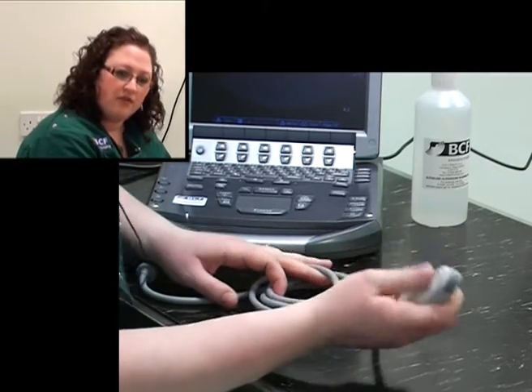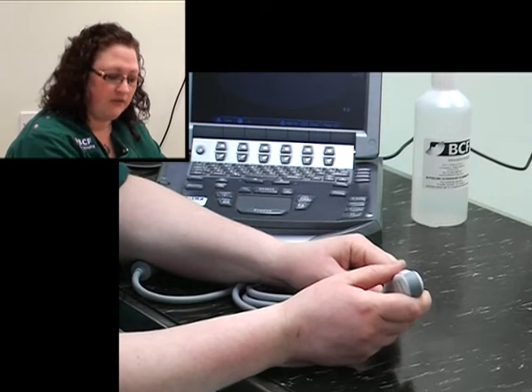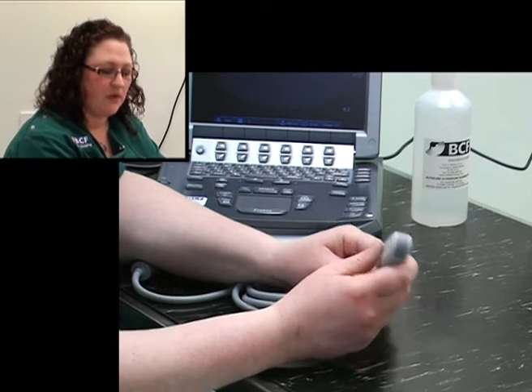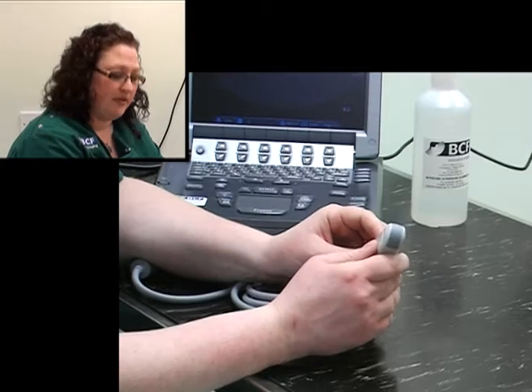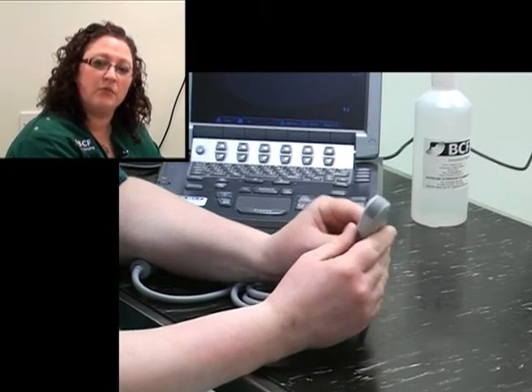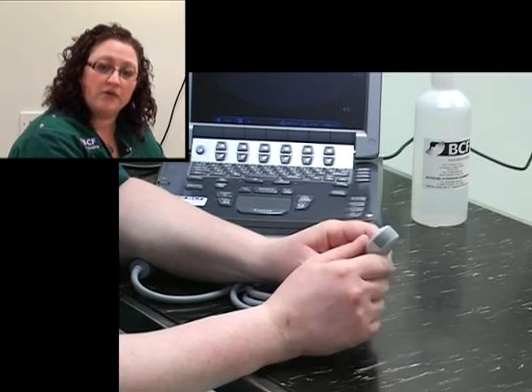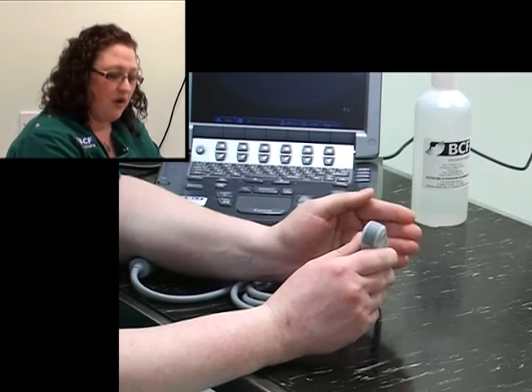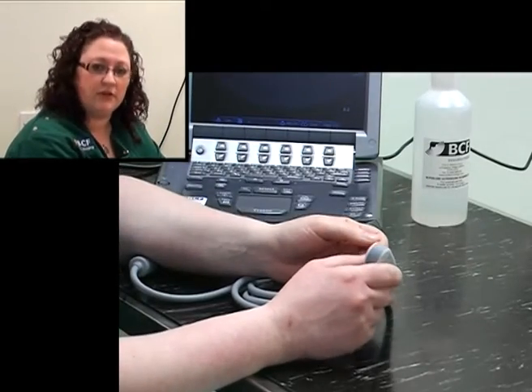Another good thing about this type of probe is that it will be very useful for a wide range of patients, all the way from cats to larger dogs. This particular probe has multi-frequency capability, which means you can actually change the frequency being emitted from the probe itself. Higher frequencies are used for better resolution, but they do not penetrate as deeply into the tissues.